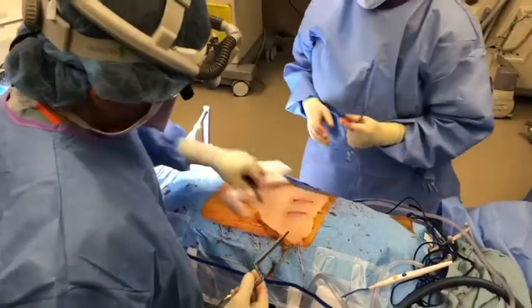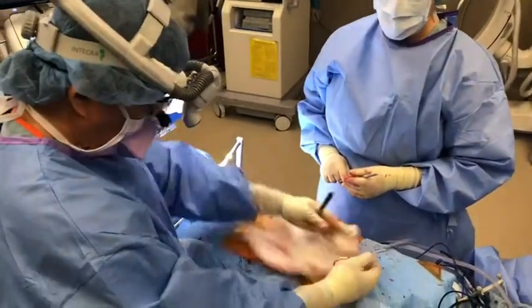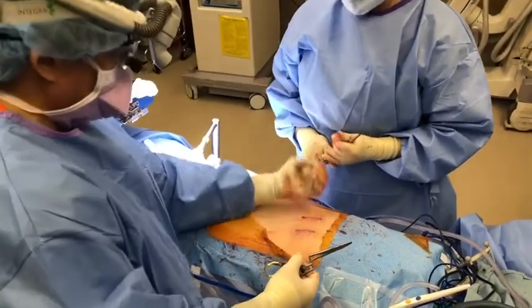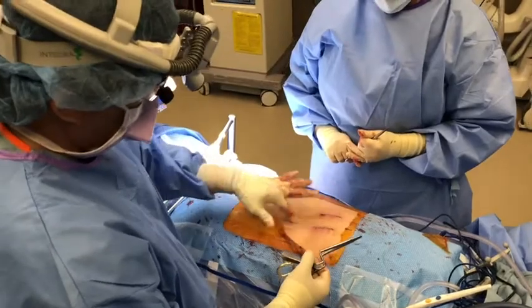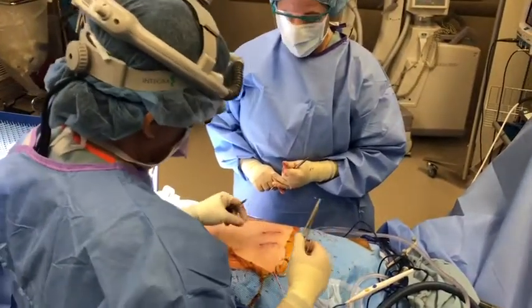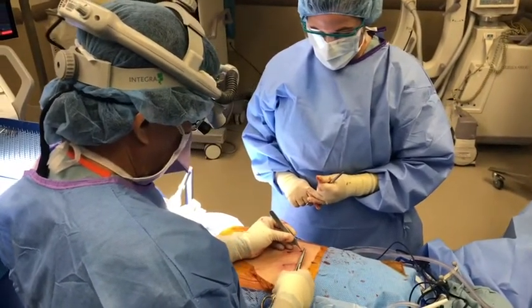I'm closing the wound and this is what makes it minimally invasive. Instead of one big long incision and stripping all the muscle off, two paramedian incisions looking down. We need the direction to try to keep the muscles and nerves intact. That greatly decreases blood loss, muscle trauma, and post-op pain.